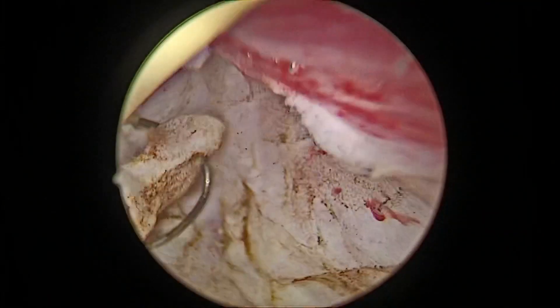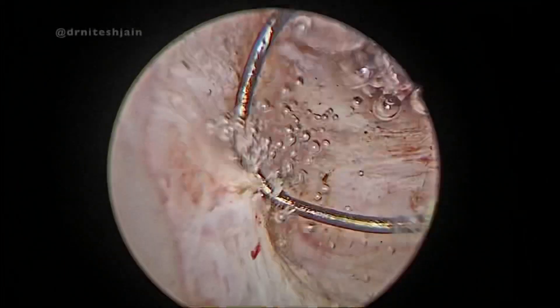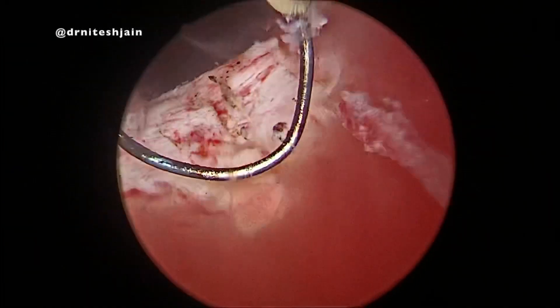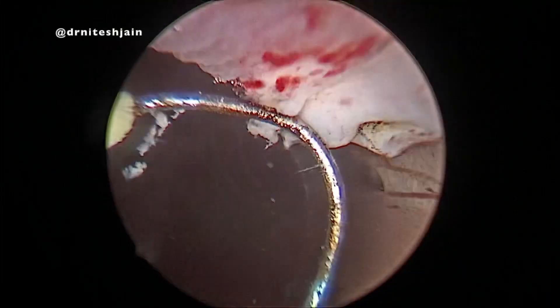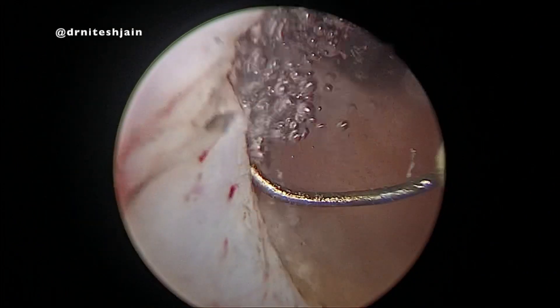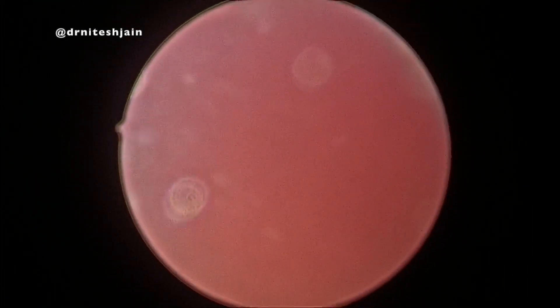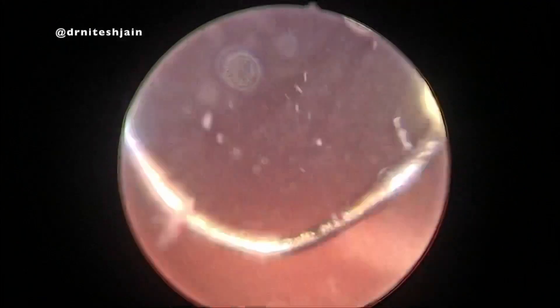The trick here is not to cut on the floor, because the abscess may erode or may have some communication, or the adjoining area may be very friable and may form a fistula. So avoid cutting on the floor. We need to do point coagulation and not blanket coagulation. The floor of the abscess should not be coagulated excessively. It will have a lot of granulation tissue which will ooze but usually will settle with irrigation.